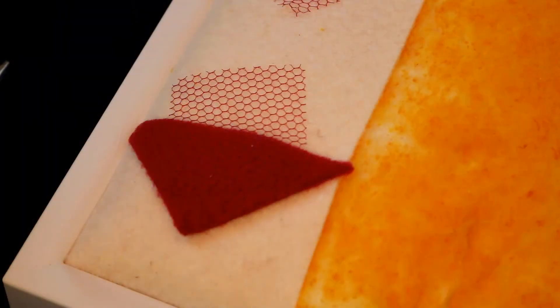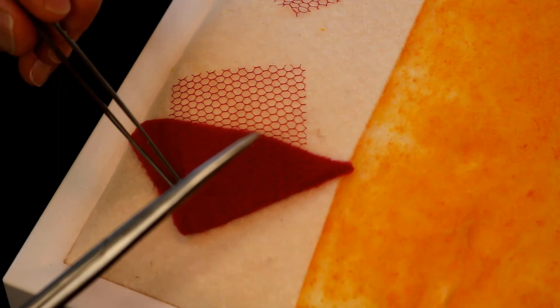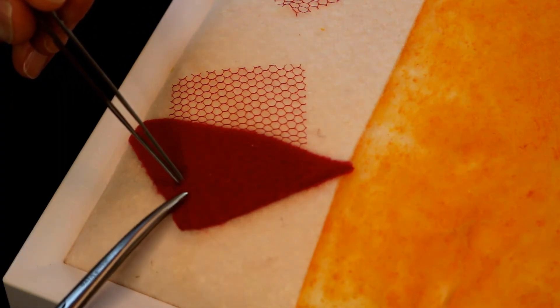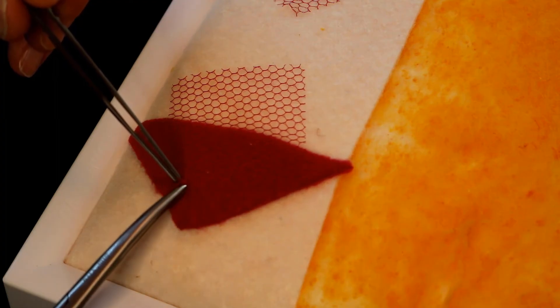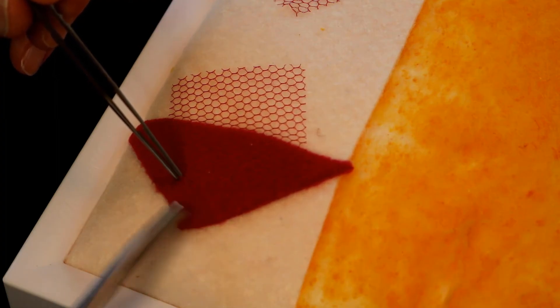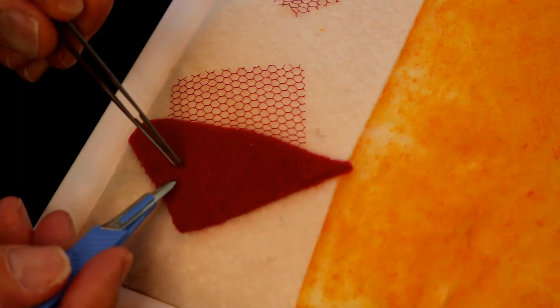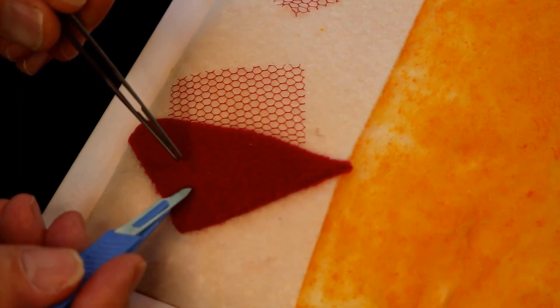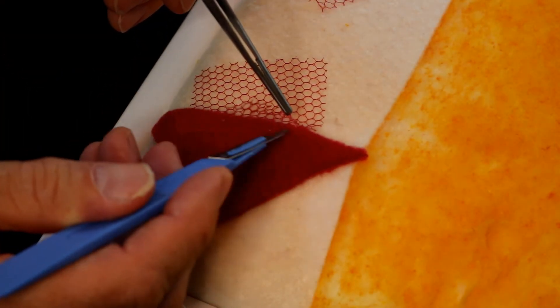There may be situations when the tissues are so adherent that the scissors just can't gain any purchase on the tissues to divide them. This is simulated by the mesh material. In this case, it's time for the scalpel. Once again, you should grasp the edge of the tissue to be removed with your forceps and retract superiorly and away from you. The knife is held like a pencil, and the very end is used to develop a plane.